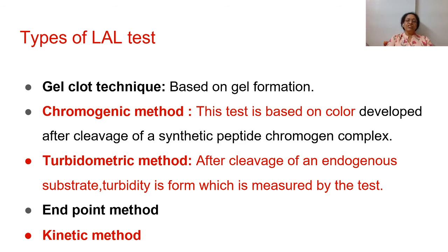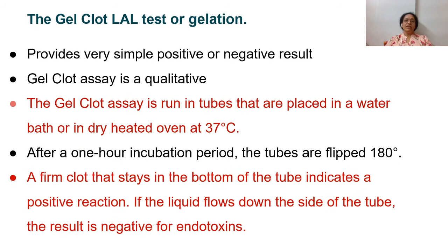The gel clot technique is based on gel formation, that is gelation, and it is a very simple method. Positive means endotoxins are present, negative means endotoxins are absent.